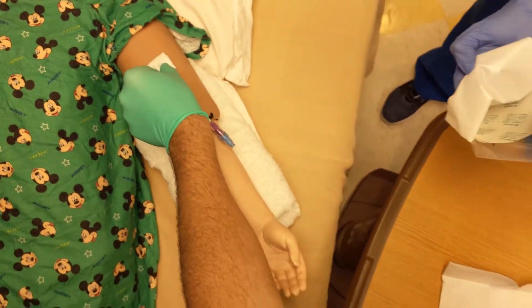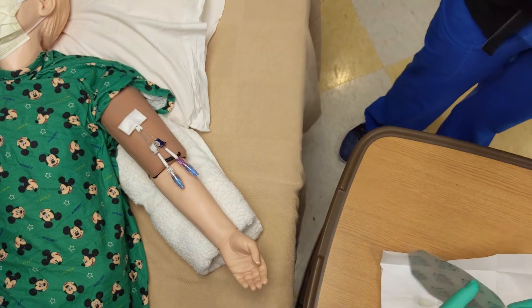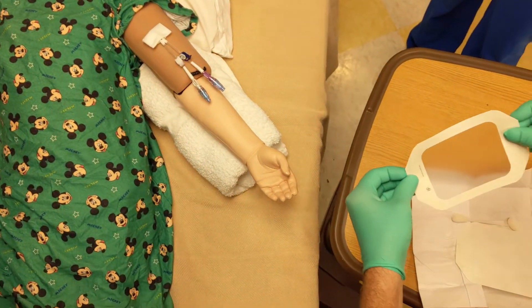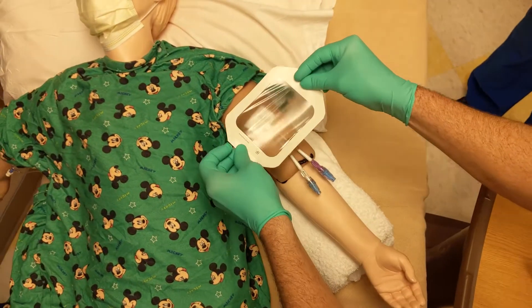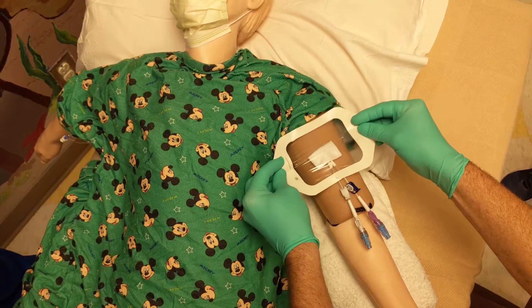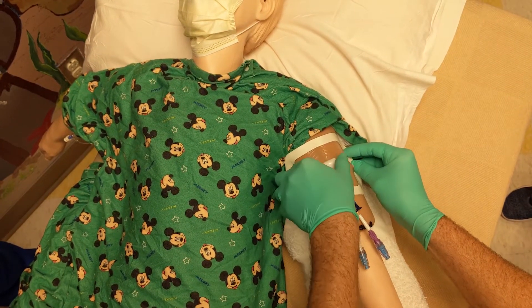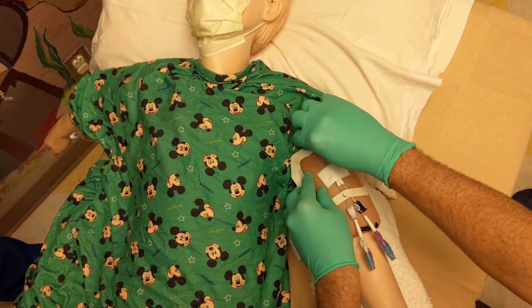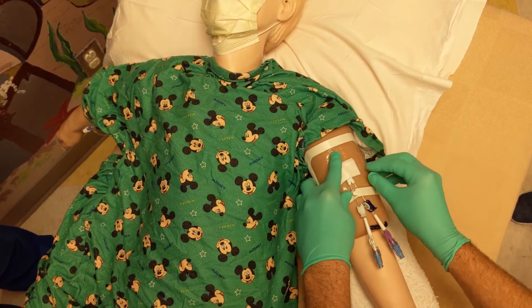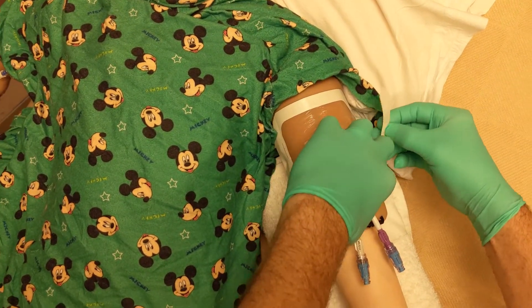Have your partner open up the Tegaderm dressing for you. You'll need to release the gauze from the patient and use both hands to open the Tegaderm. Notice that he grabs both sides of the Tegaderm and holds it straight out — if you grab only one side, it might stick to itself. Hold it with two hands and place it over the patient's line. Leave the outside border on until you have placed it on the patient. Once you've placed it on the patient, you can remove the border, as leaving it on helps prevent the Tegaderm from sticking to itself.